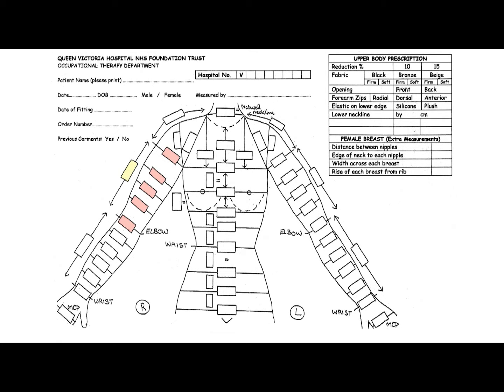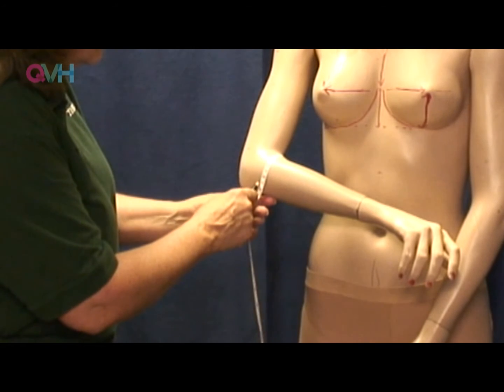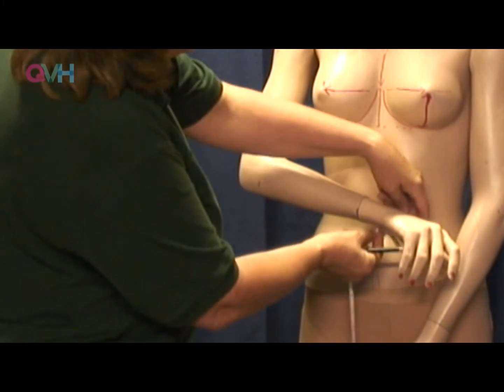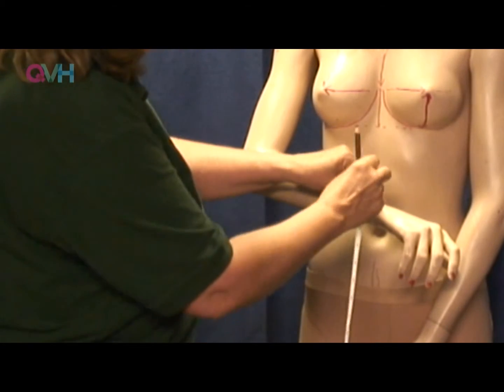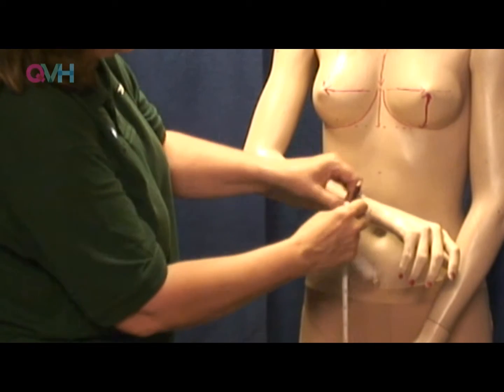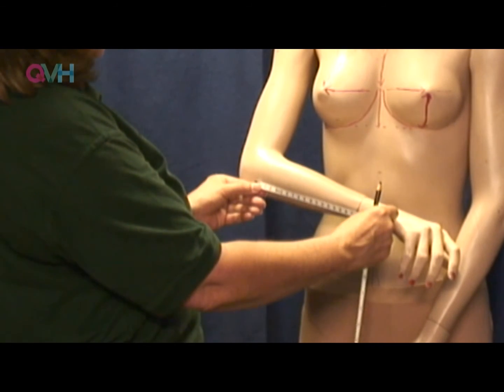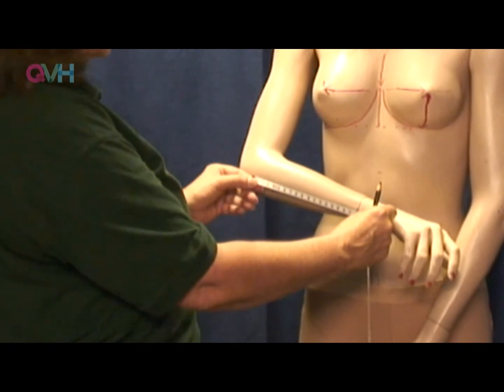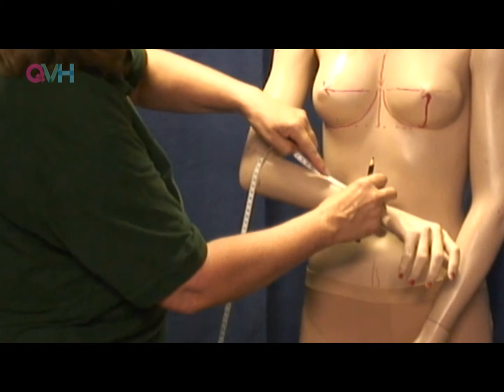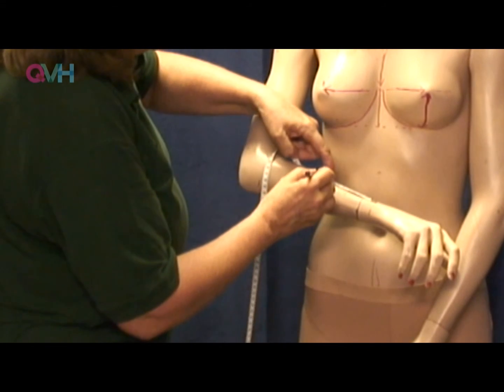Now once again, when we're travelling down the forearm, if we are taking the garment down, I would then take another mark from there and realise I was heading for the wrist, and take another mark at the wrist. As well as recording those circumferential measurements, I've now conveniently got 20, and I will go quite comfortably into 4 lots of 5.